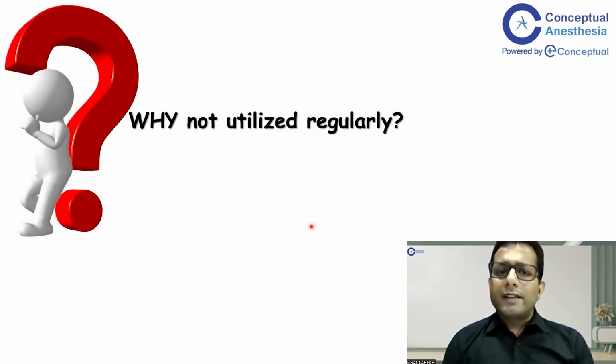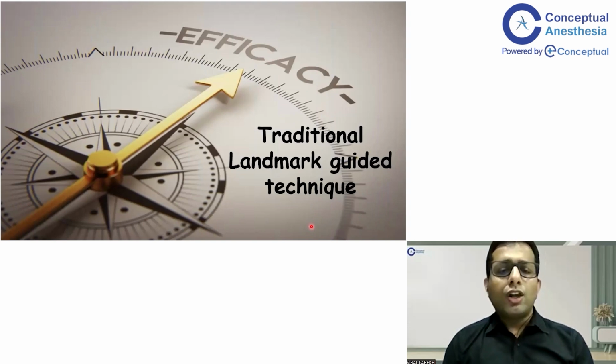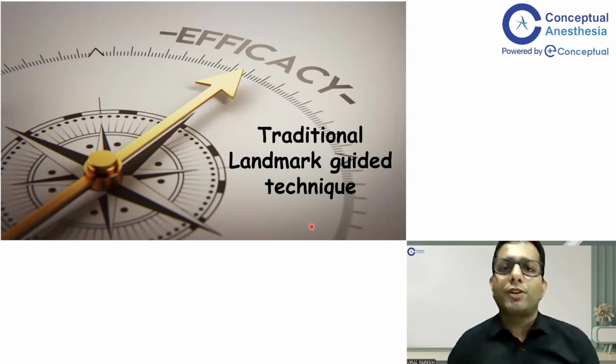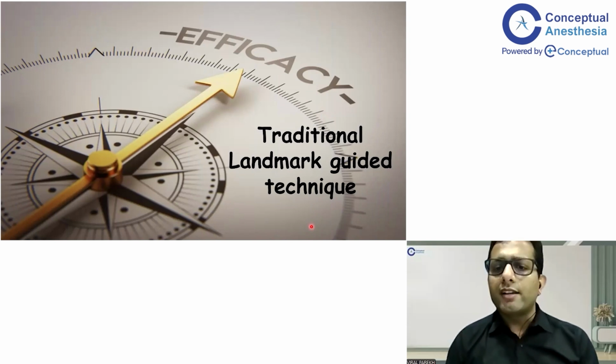So in spite of so many benefits, why is it not utilized regularly? All of us have most of the time heard from our seniors that they have been practicing spinal or epidural for more than 30 years, 40 years, and they have been using the traditional landmark guided techniques. So it definitely has a higher efficacy, and that's why ultrasound is still underutilized.